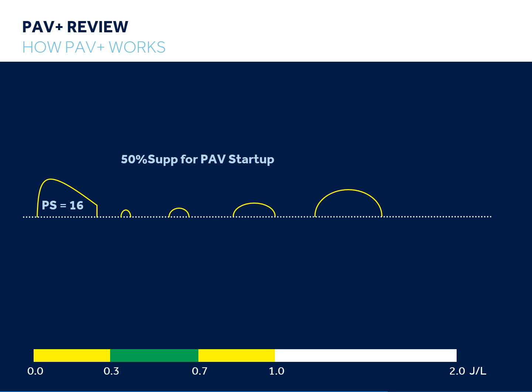There are a couple advantages of using 50% support to go through the startup phase. The first is that with the 50% support setting, the amount of support provided by the ventilator should be a mirror image to the amount of respiratory effort. And since the ventilator doesn't actually draw the green effort indicators shown in this presentation, one can estimate that the patient effort would be a mirror image of the support provided whenever the 50% support setting is used.